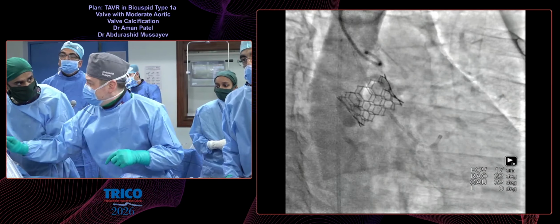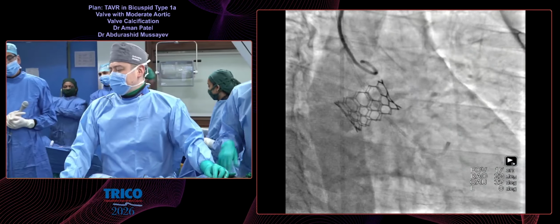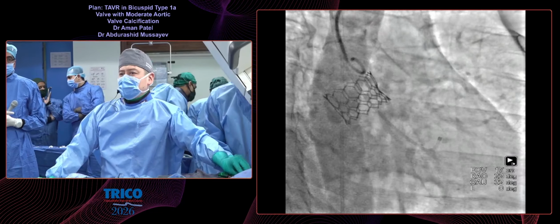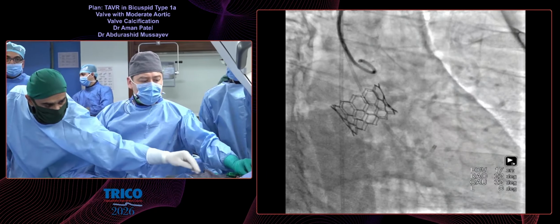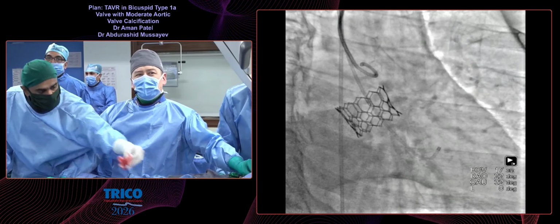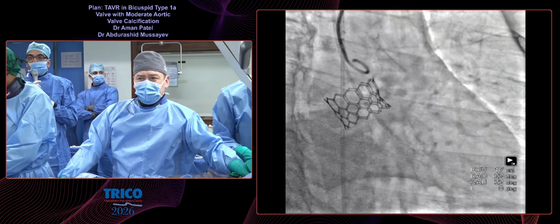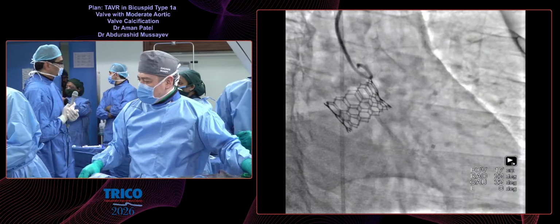Please, Angio-Seal 8 French. In our center, we use one femoral, one radial access, so that leaves less chance of another groin complication. And here, digital subtraction: what do you do from the contralateral femoral? No, I think it is not necessary. Their second access is left radial. Dr. Chef, can you come for echo? 8 French.